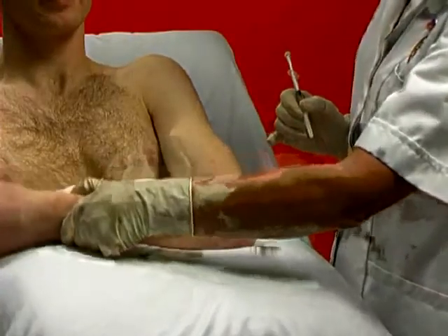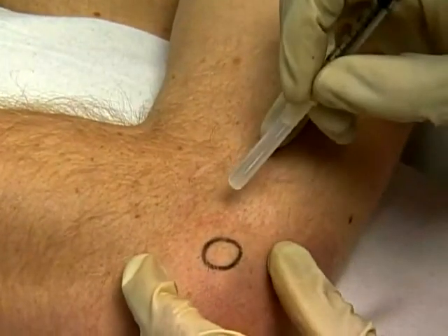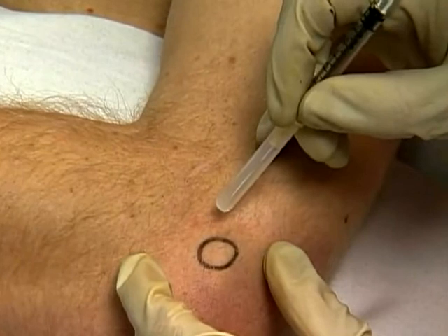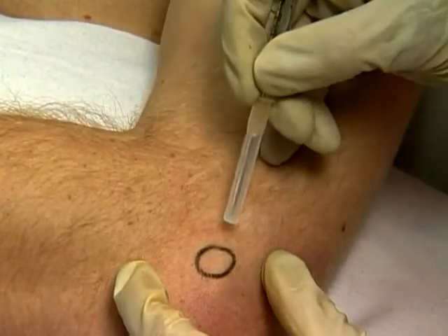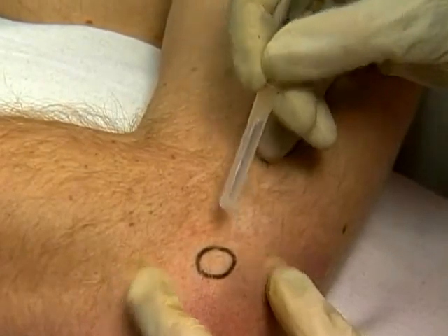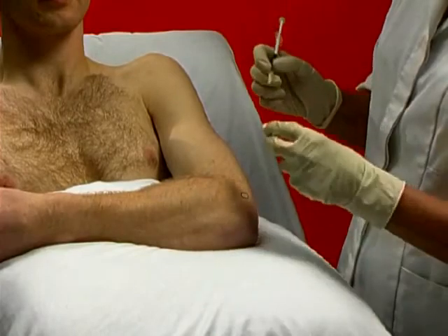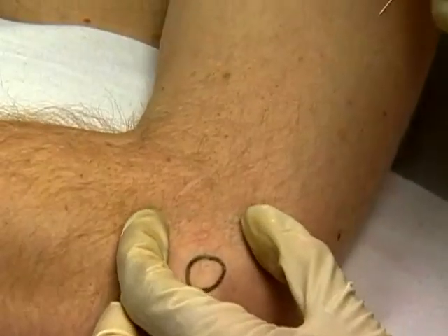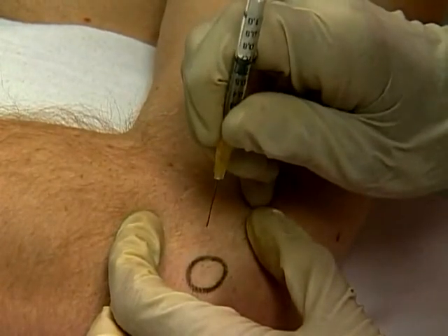Position the patient with the elbow at right angles and forearm supinated. Palpate the facet on the lateral epicondyle, and the entry point immediately anterior is marked and cleaned. Use a 1 ml syringe containing 10 milligrams of steroid and 3/4 ml of 2% local anaesthetic, and attach a 25 gauge half-inch needle.